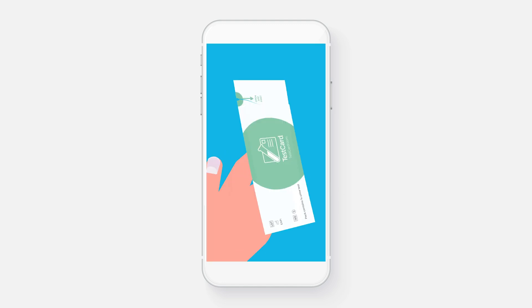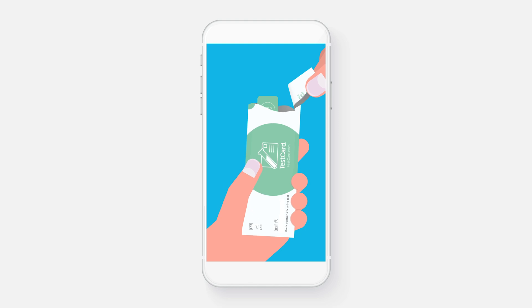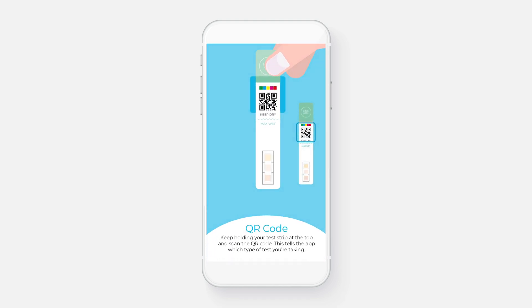Step 1. Open one pouch and hold the test strip at the top so you can scan the QR code. This tells the app which type of test you're taking.